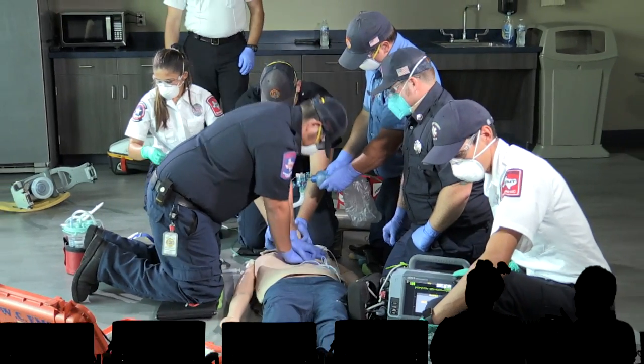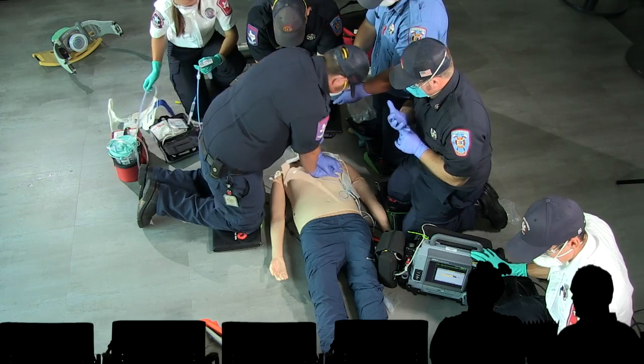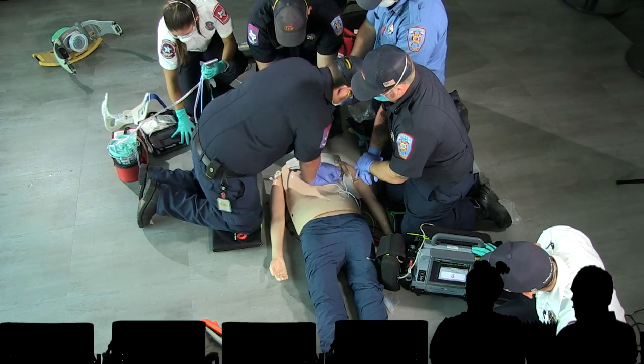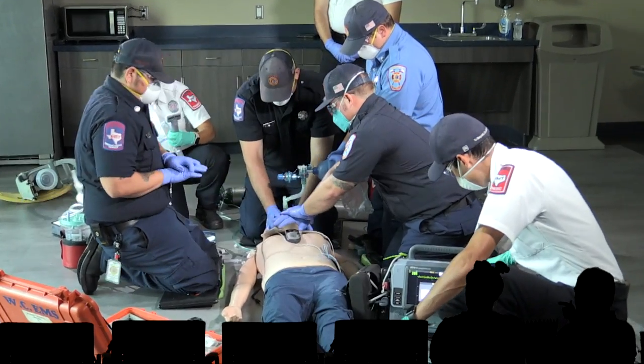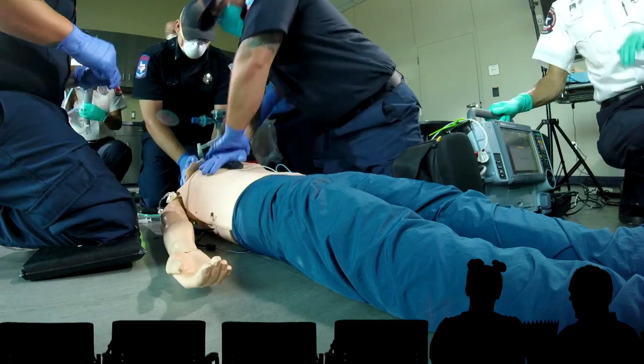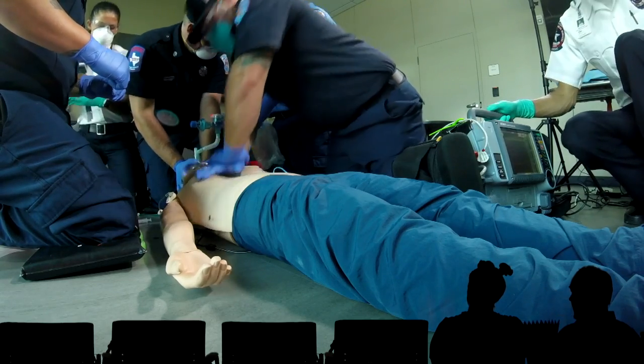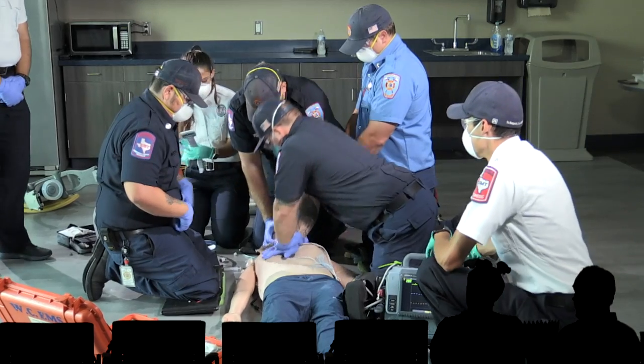That's where we'd put him. He's going to do the dual-sequential defibrillation. He's got one, and he's going to pop the second one — the hover maneuver. Didn't even void a life pack warranty. I like it. And now here comes Abby with the King Vision in her hand.